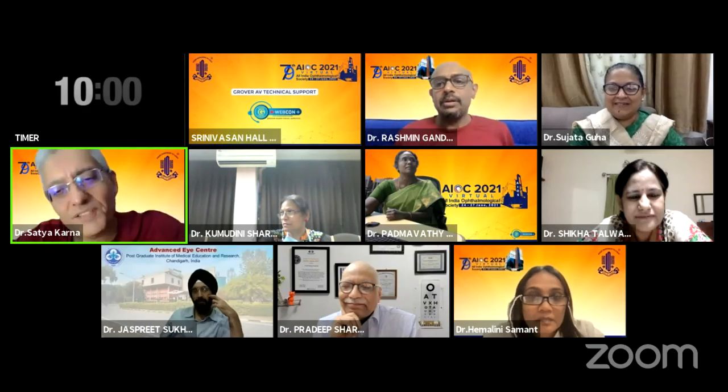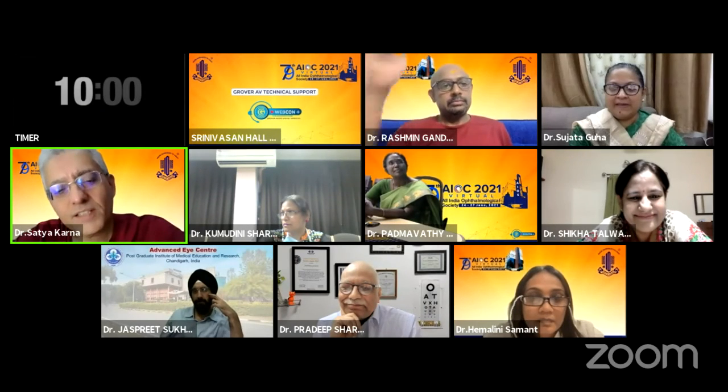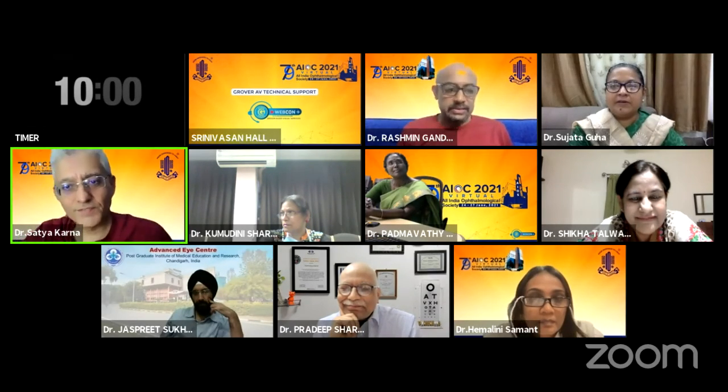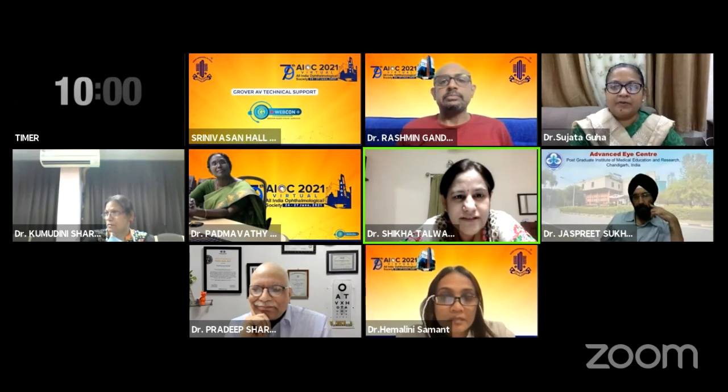I just have a question for Shikha. Most ophthalmologists have a particular model of OCT. Traditionally, they bought it 2 years, 4 years, 10 years ago. Do you think the EDI OCT is really necessary for neuro-ophthalmology? Are those ophthalmologists neuro-ophthalmologists?